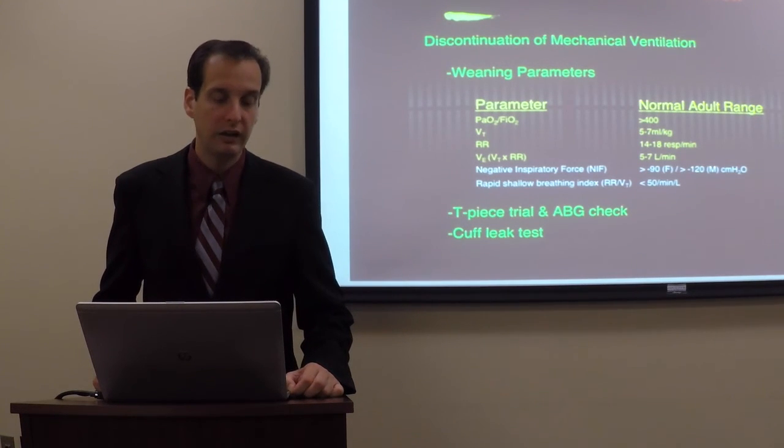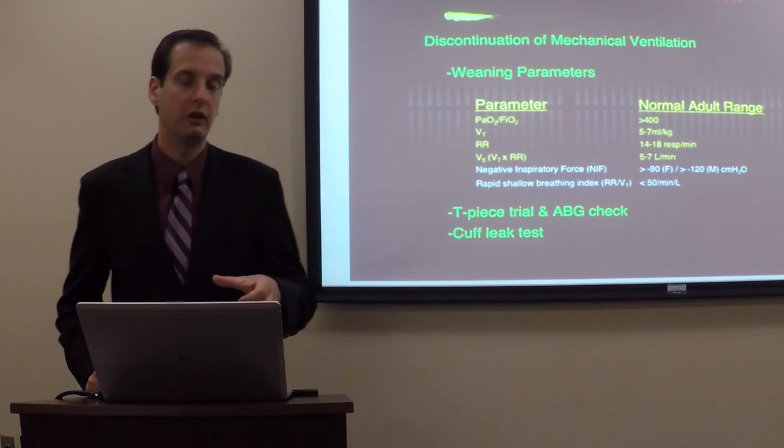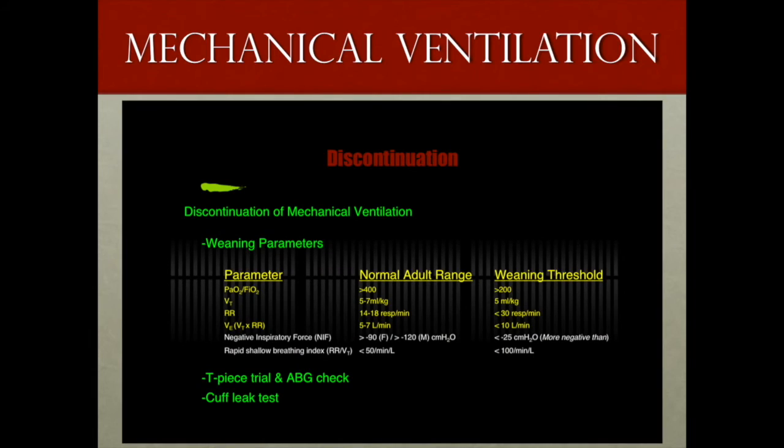If you do not hear air moving around the tube, it means that the balloon has been deflated and now their airway has swollen around the tube, such that there's an airtight seal around the tube. And if the tube is then removed, the likelihood of the swelling continuing and the patient's airway becoming compromised is high. And if the tube cannot be reinserted, the patient has a critical airway situation at that point.